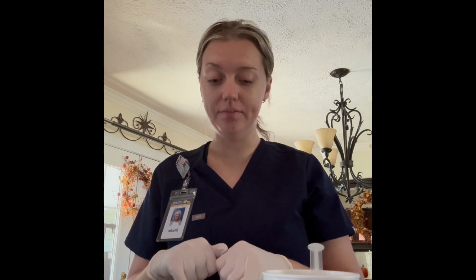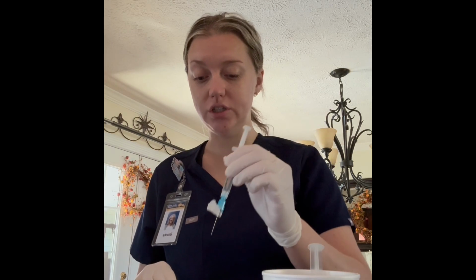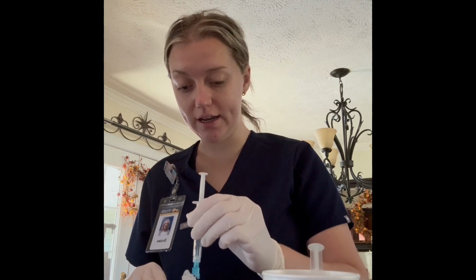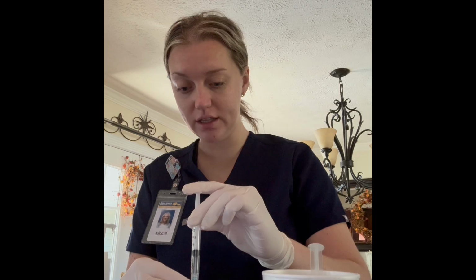So I would begin by cleaning the area with an alcohol swab, starting in the center and working outward in a circular motion. I would then allow that to completely air dry, and then I am going to take my syringe with the medication, and I am going to uncap the needle, and then I would inject the needle at a 90-degree angle, stabilizing with my non-dominant hand, and inject the medication slowly.